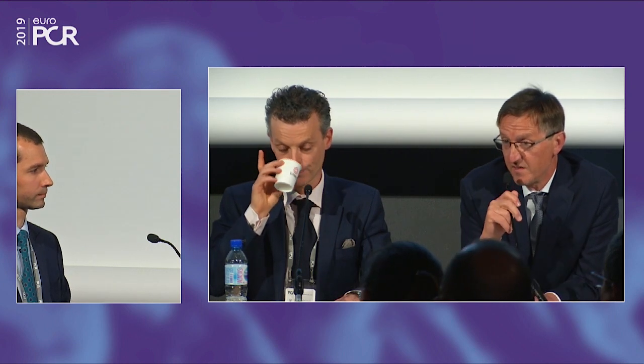There is this publication in EuroIntervention where they observed the calcium, and this is a kind of rule of five, meaning that if the depth is more than 0.5 into the vessel wall, you can see that with OCT and not with IVUS. And when the angulation is more than 180 degrees, and when the length in the longitudinal plane is more than 5 millimeters, then you have the highest score and the highest risk of ending up with an underexpanded stent. So this is just a scoring system indicating that you should do something more than just ballooning.